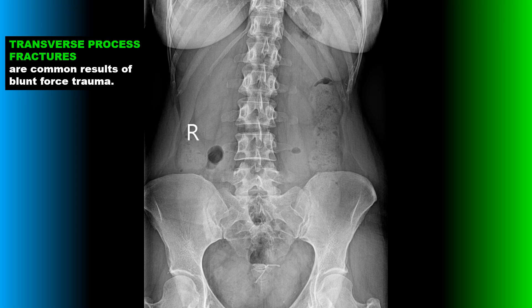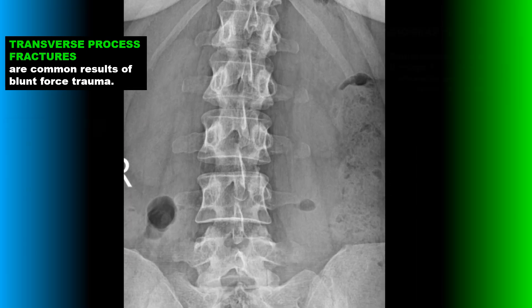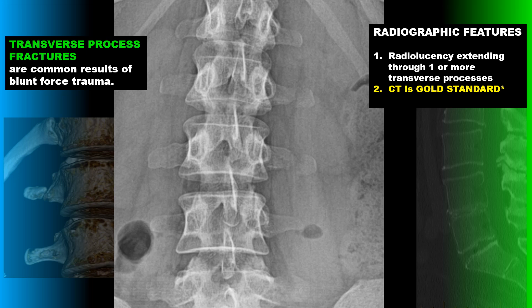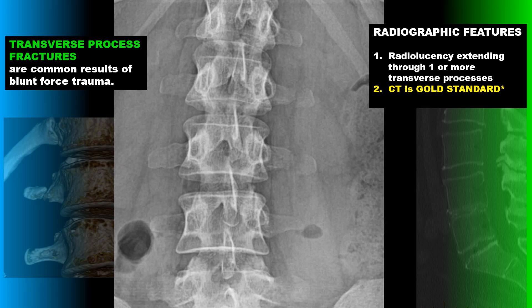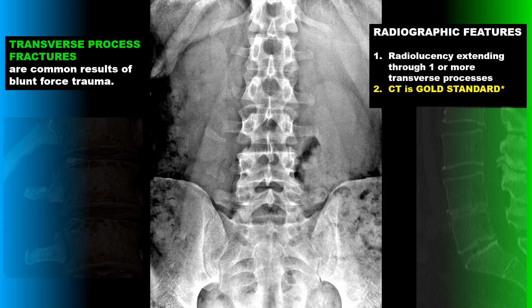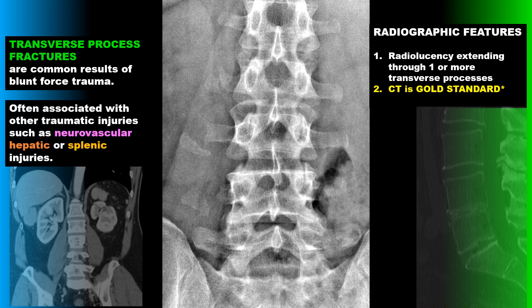Another common fracture of the spine is transverse process fractures, usually a result of blunt force trauma. Radiographically we're looking for radiolucency extending through one or more of the transverse processes, which can be very challenging to see. CT is the gold standard for finding a transverse process fracture. These are often associated with other traumatic injuries such as neurovascular, hepatic, or splenic injuries.